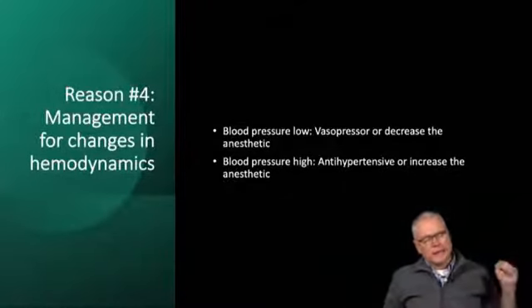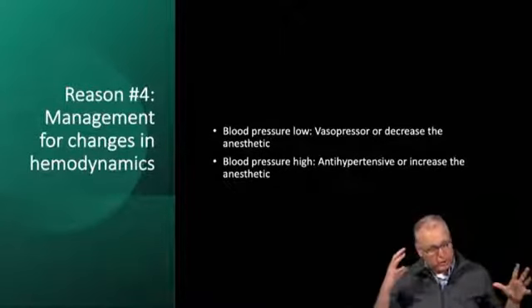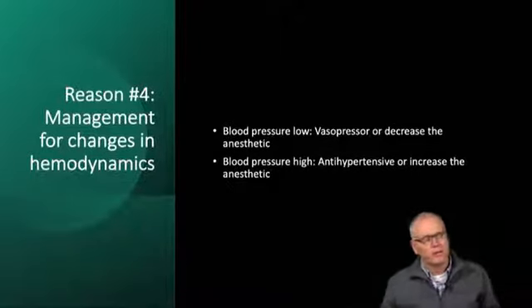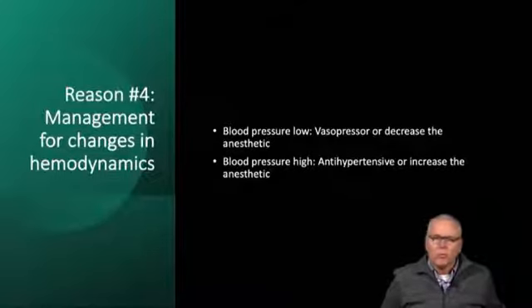One, it's low because you have too much anesthesia, or another one is that you have a person who's cardiovascularly impaired and just with a normal amount of anesthesia can't maintain a reasonable blood pressure. How will you know unless you know what the brain's doing?